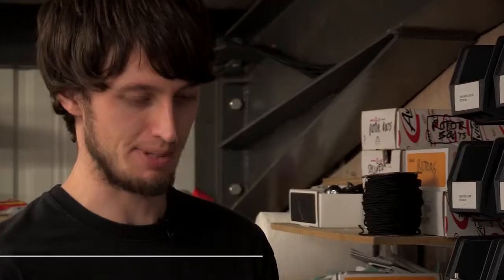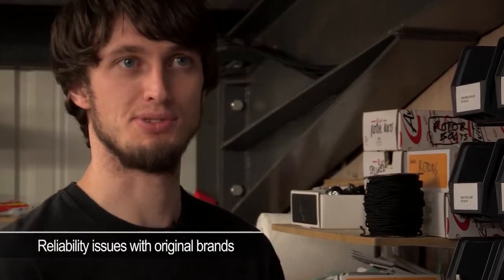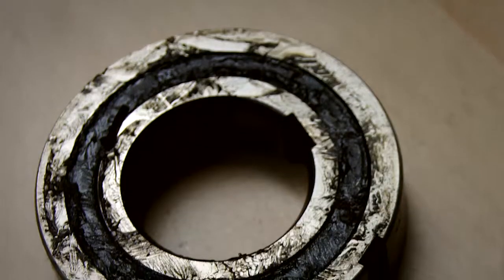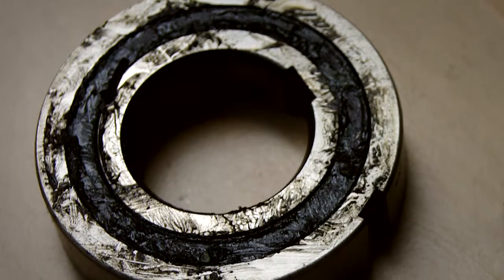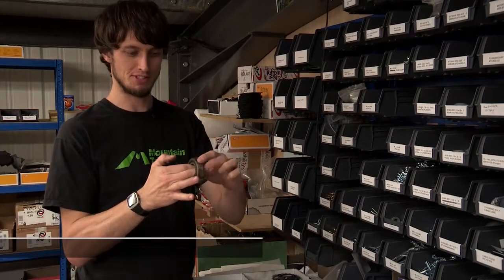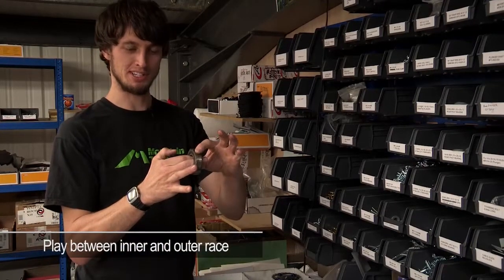We tried a few different brands and had lots of reliability issues — some of them failing after only a month's use, some even less. Here are some of the poorer quality brands we tried, but they really haven't lasted long enough and have lots of play between the inner and outer race.